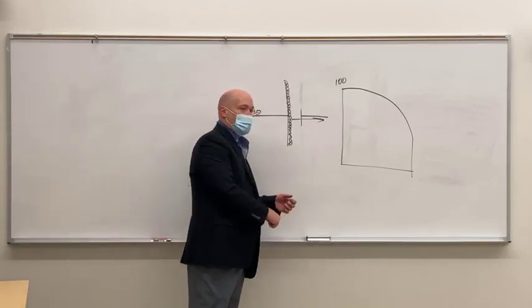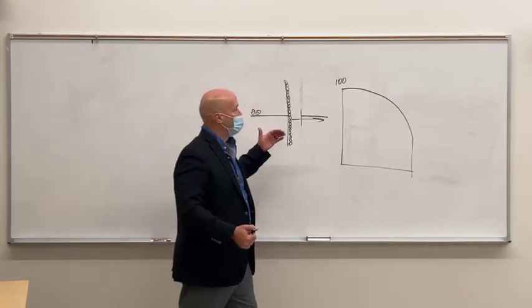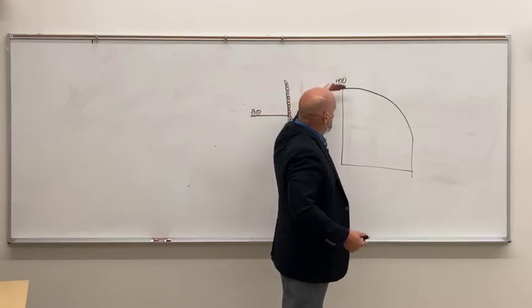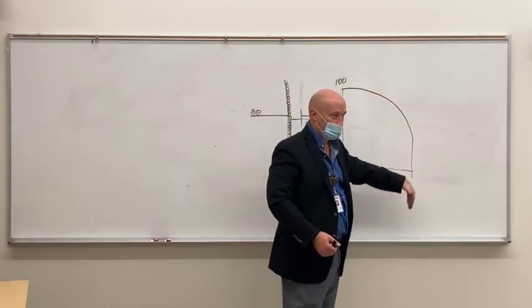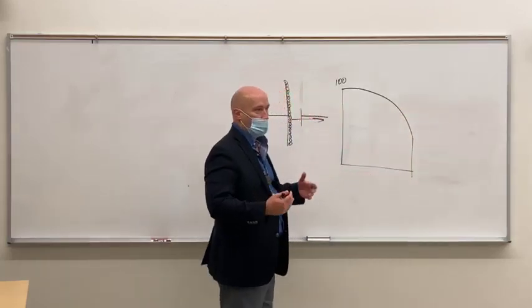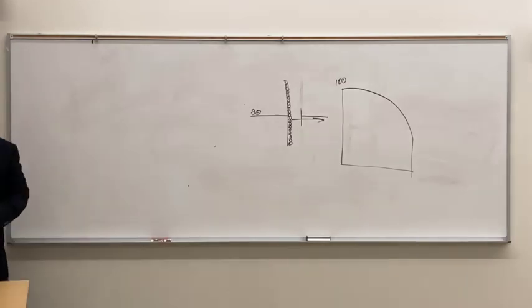You've got to plug the machine in, build up this charge, get the charge ready, make the exposure. Once the exposure is made, your kVp drops consistently throughout the exposure until it gets to a point where, you know, it's got a useless charge at that point. Okay?